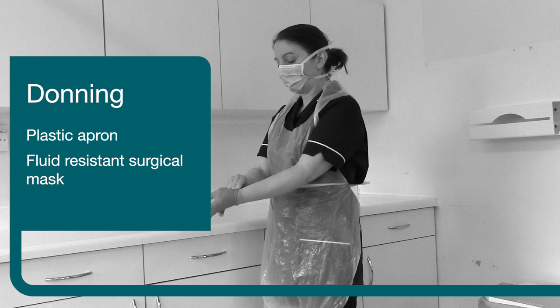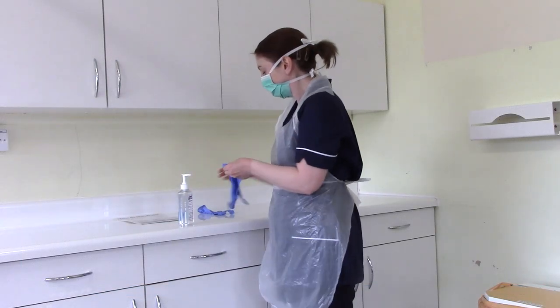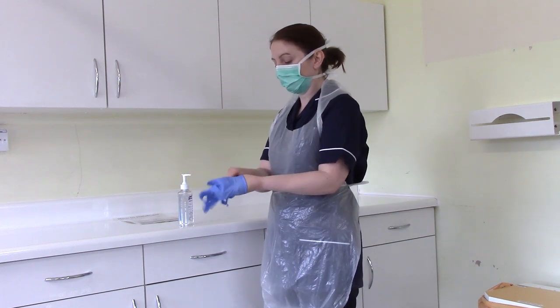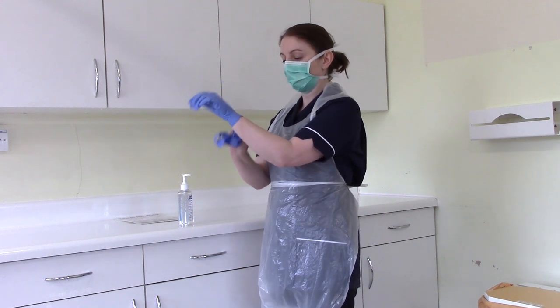Step three: disposable gloves. Gloves should be selected appropriate to hand size and should be well fitting. They should cover the wrist and must be changed immediately if a puncture or perforation is suspected.